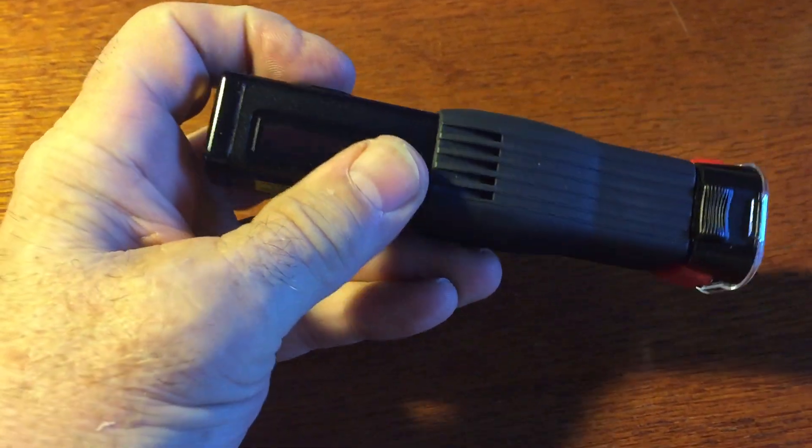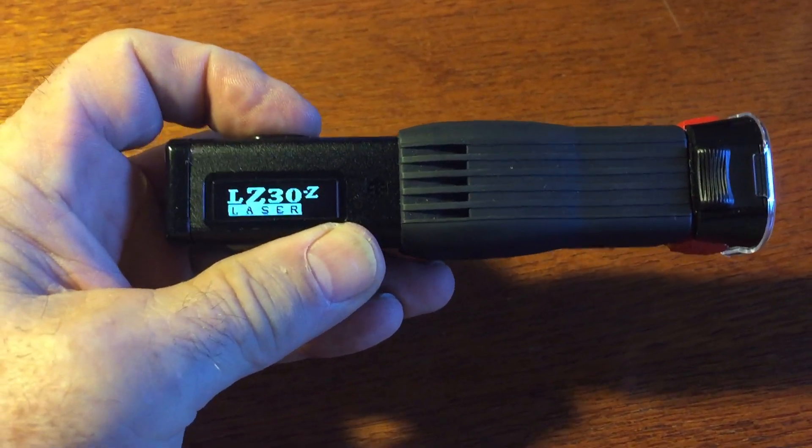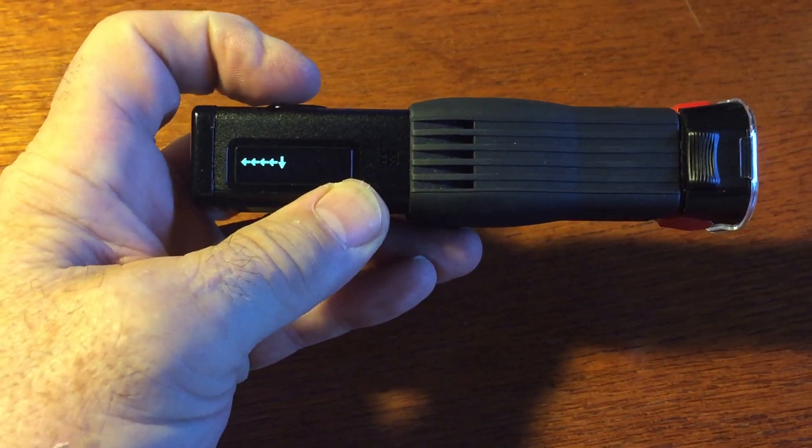To turn it on, you hold it down and it turns on like this. Then you enter the password — beep, beep, beep, beep — and enter that.